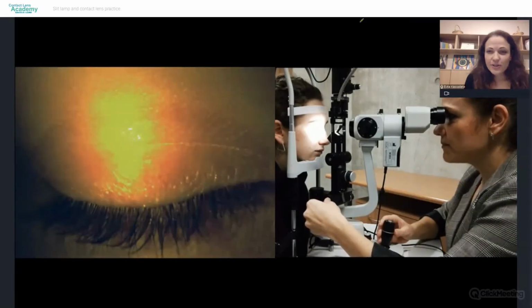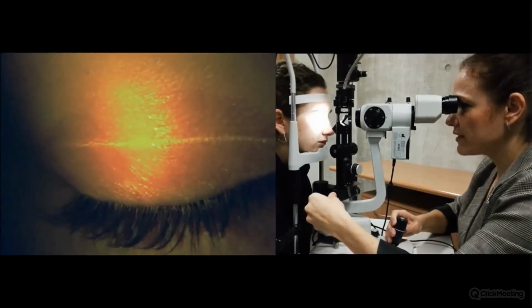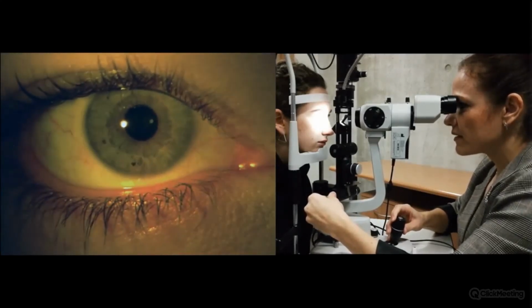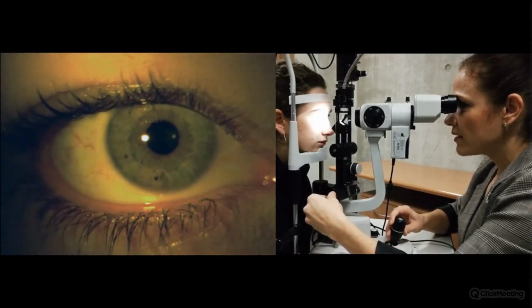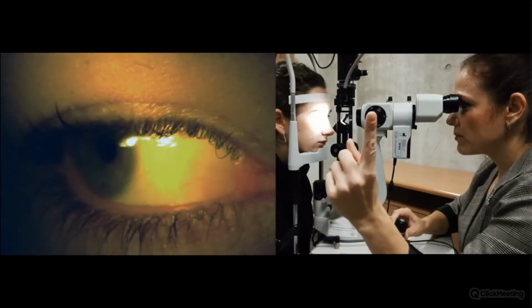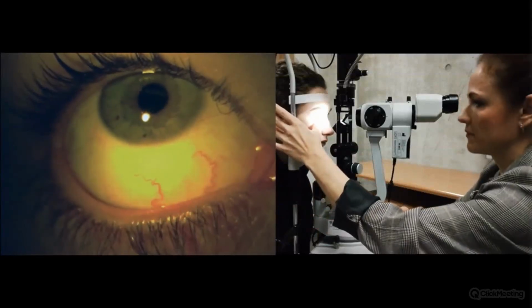In this case, you see that we have evaluated the eyelid and lashes in general with a diffuser. Here we use this diffuser that better divides the light over the whole eye. Then we look at the bulbar conjunctiva and ask the patient to look in one position and another. In this case, we evaluate this bulbar conjunctiva.